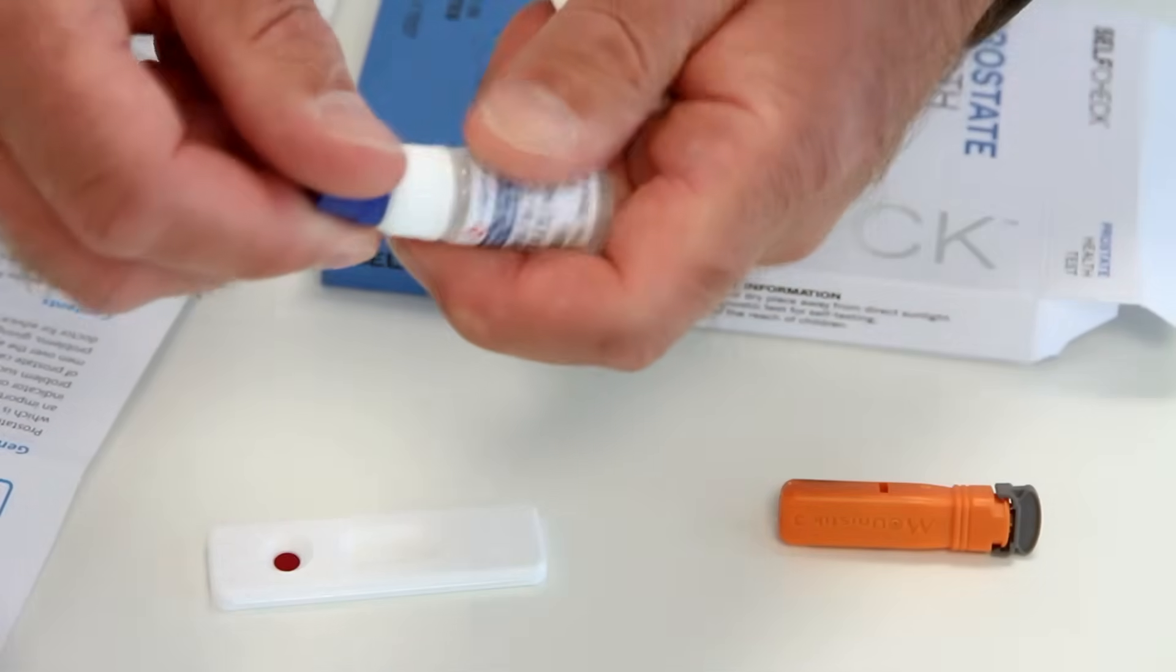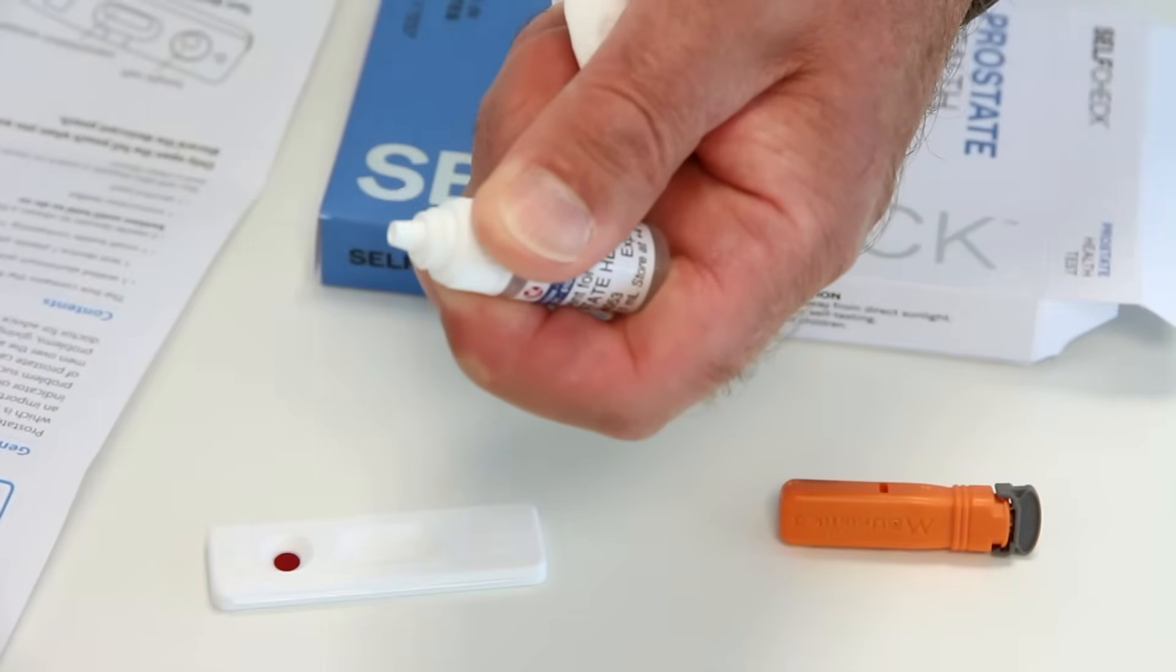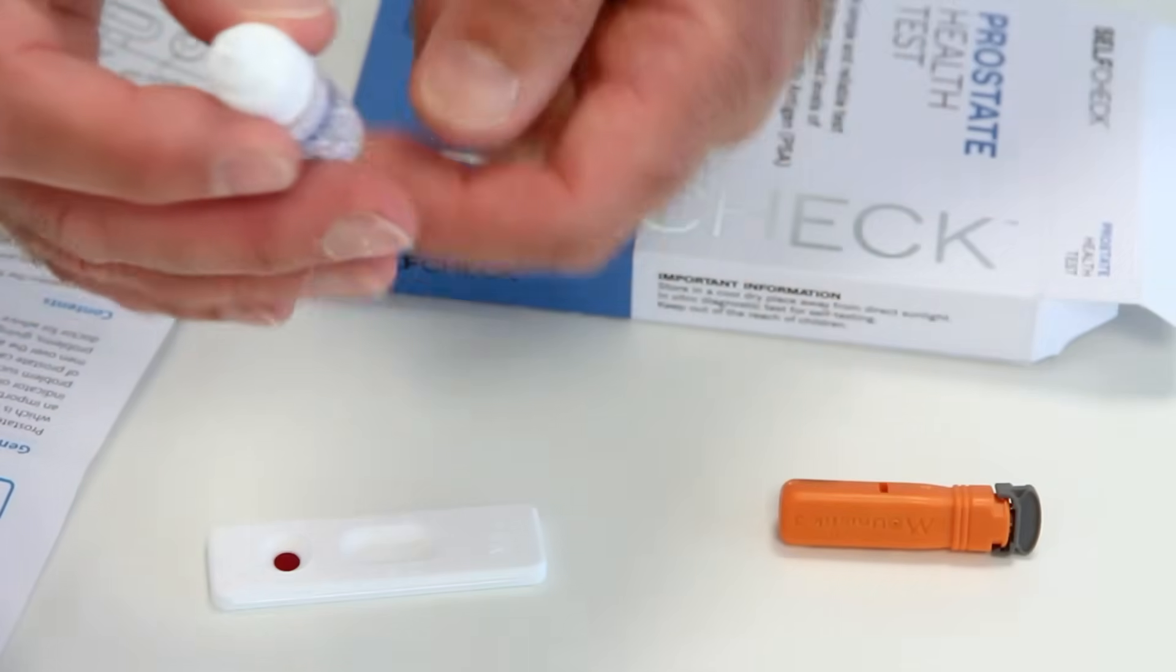Then unscrew the blue cap from the diluent bottle and add the required number of drops of diluent to the same well that you added the blood to.